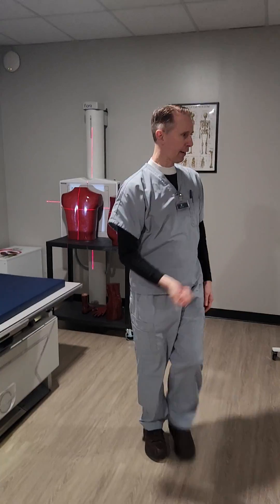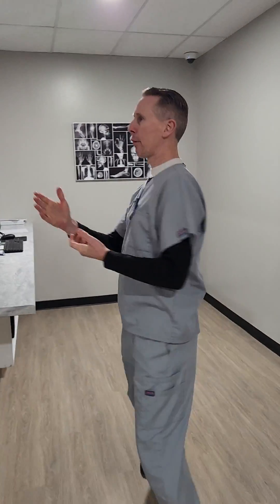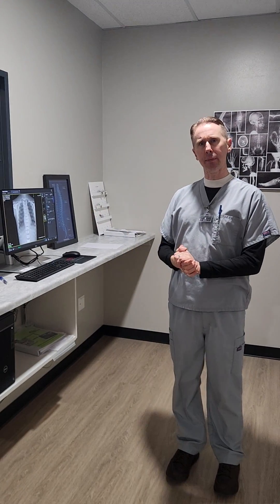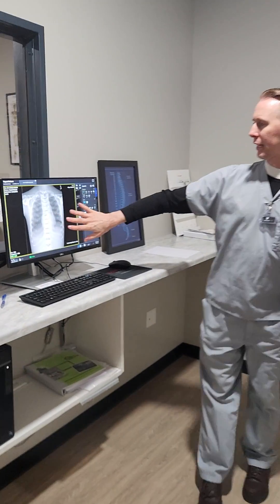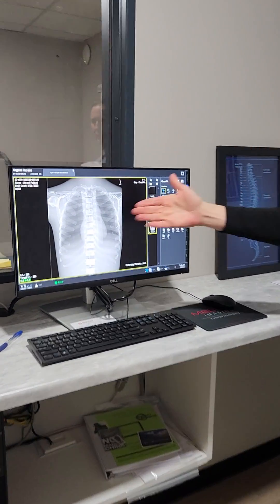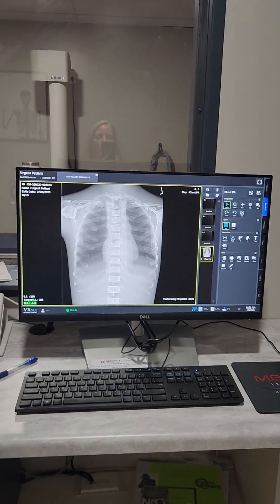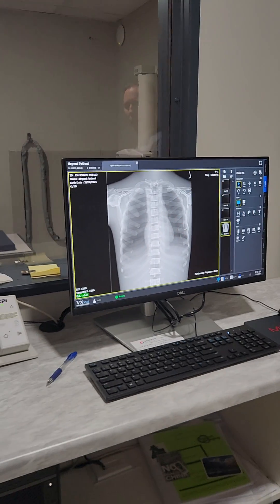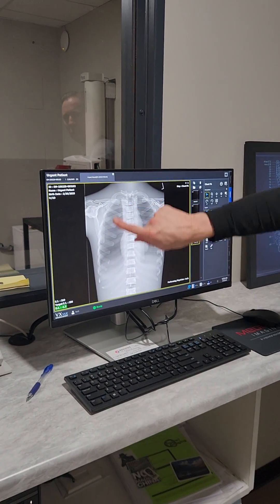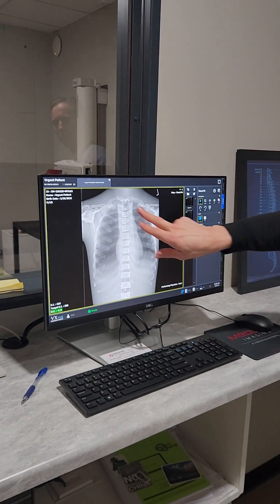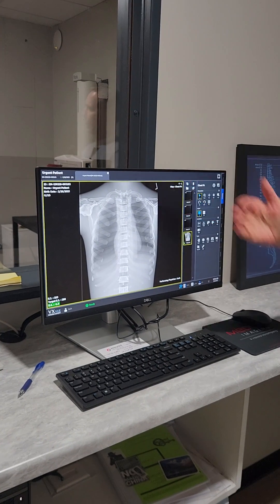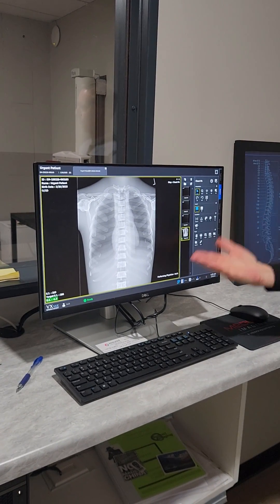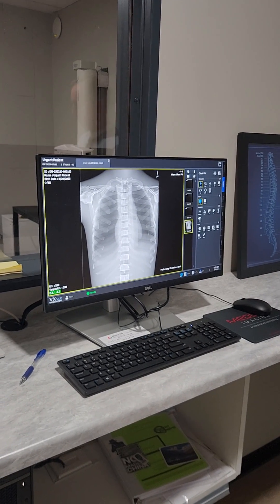Let me show you what a chest x-ray would look like. I have set up this for a chest x-ray. This light field is called our collimation — where the light goes is where our x-ray will be taken. We've come behind this lead wall, so we're 100% protected from any radiation. As you can see, we have taken a chest x-ray of that phantom. This is exactly what we would see in the diagnostic field of imaging. We have our lung field, and you can see the spine and ribs. This is your typical what we call a PA projection of a chest x-ray.